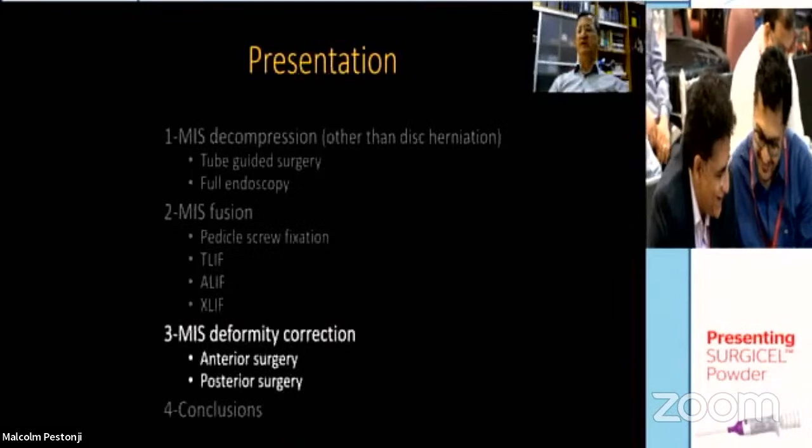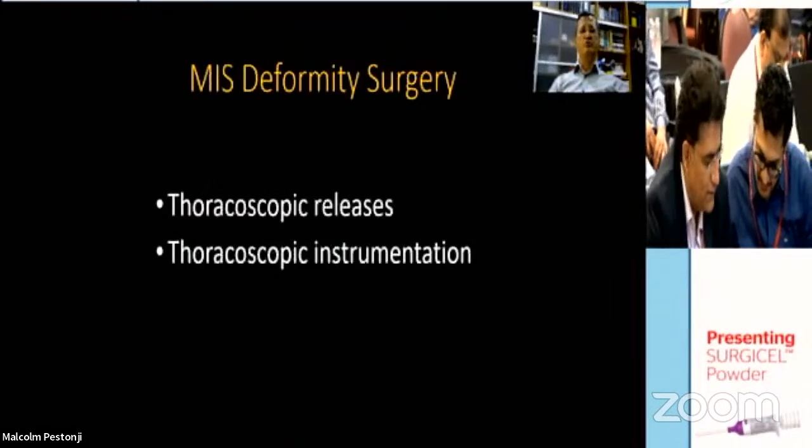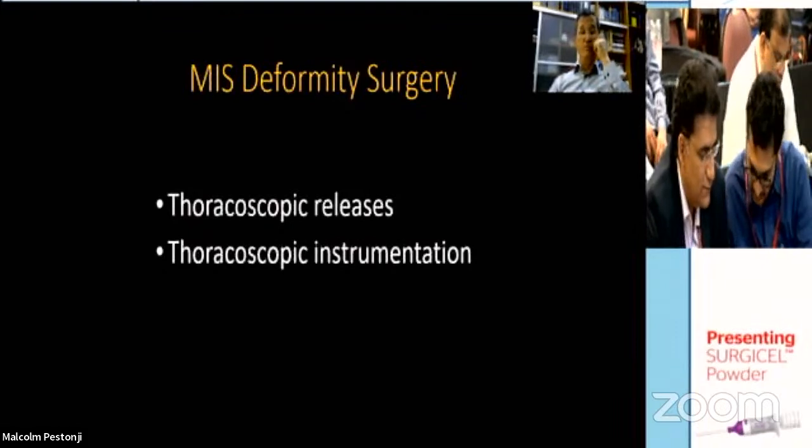What about MIS deformity correction? There are different techniques: thoracoscopic releases, thoracoscopic instrumentation.